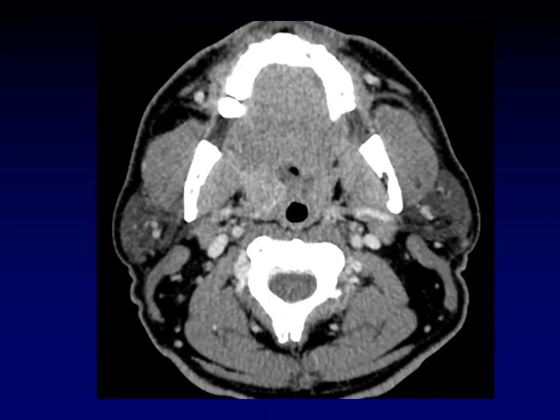Here's another example of squamous cell carcinoma arising within the tonsillar pillar. Note the relationship to the parapharyngeal fat — we're pushing it out laterally. This is another heterogeneously enhancing mass within the palatine tonsil itself, not deep to the palatine tonsil but within it. This is another squamous cell carcinoma.